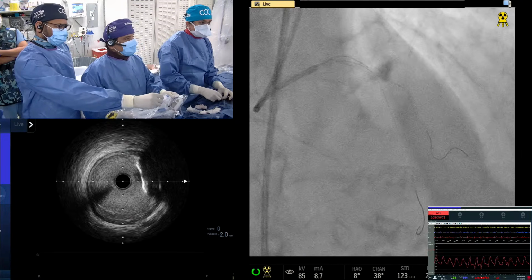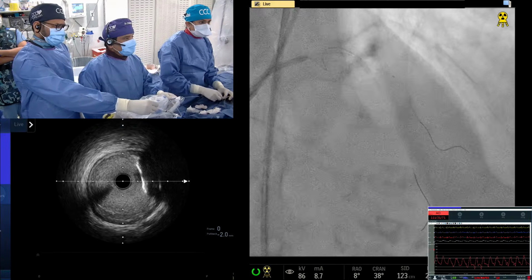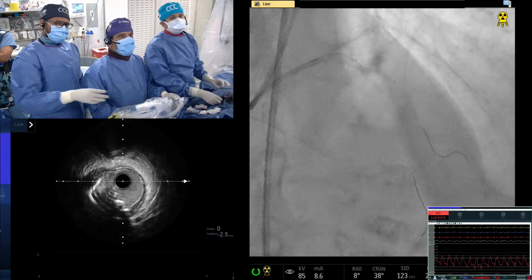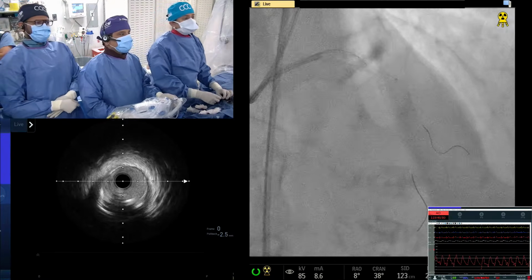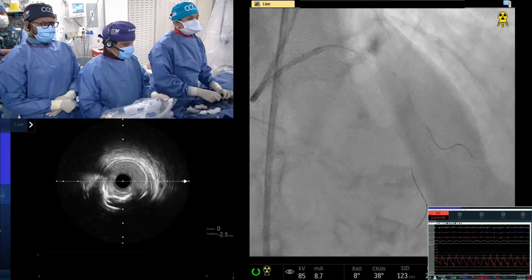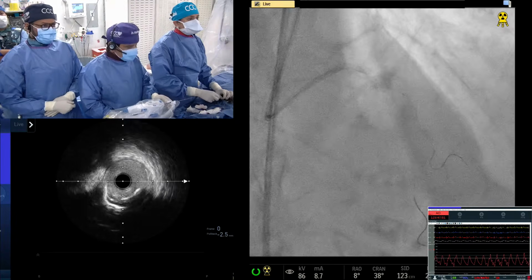Even there it's not good. Can you see the IVUS of the ostium? I checked the image. Look at that. So it looks like it's the proximal LAD. Is your IVL use the same, decreasing, increasing?